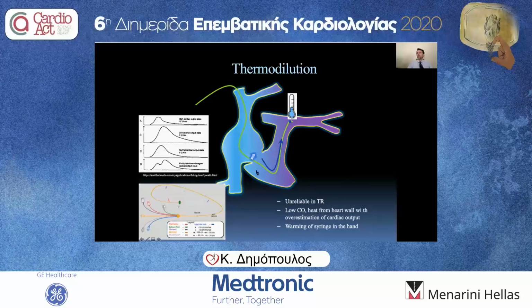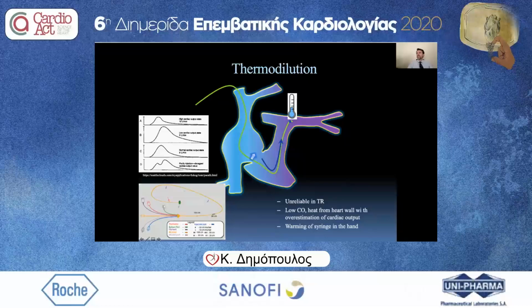If the cardiac output is too low, then the heat from the walls of the heart can heat the blood and give us overestimation of cardiac output. And of course, we should not be holding the syringe in our hand for too long.